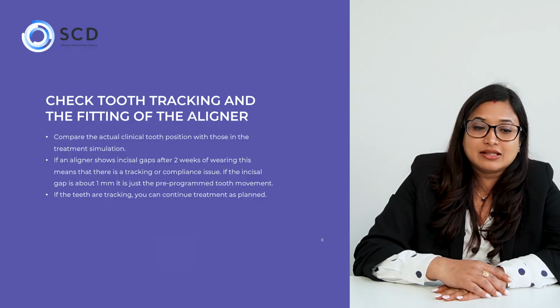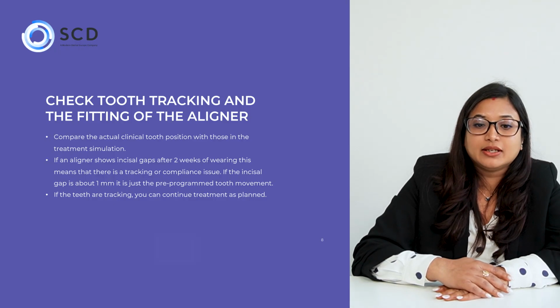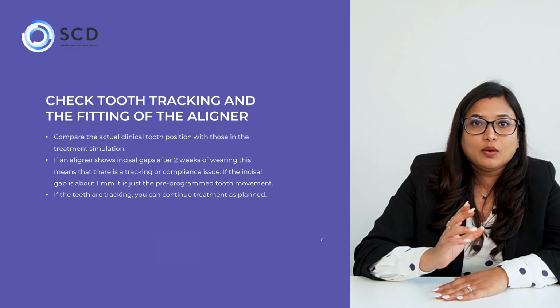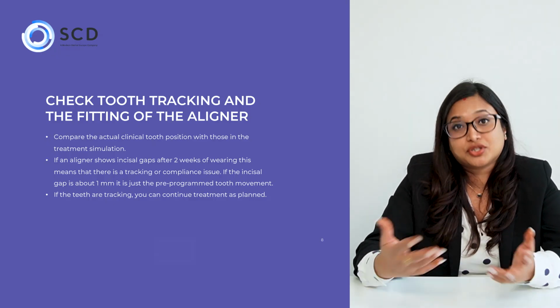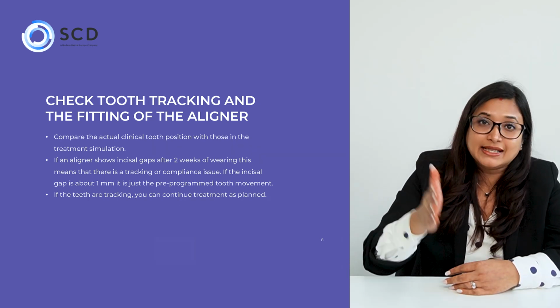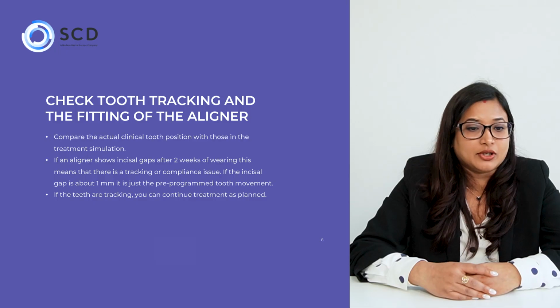Next one on the checklist is to check the tooth tracking and the fitting of the aligner. It is very important to compare the actual clinical tooth position with those in the treatment simulation. When we submit a case for clear aligner solution with TrioClear, you will receive a design on the iDesign platform, and you will receive a clinical simulation. So at each stage, you can compare whether the clinical situation in the mouth is matching that of the clinical simulation.